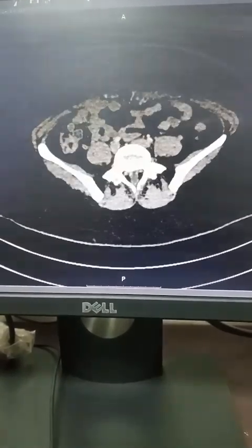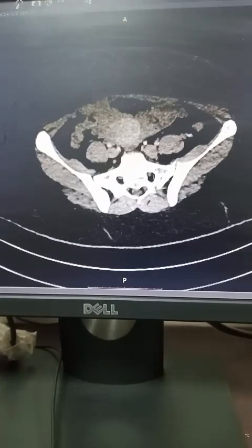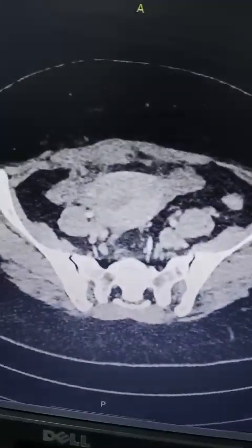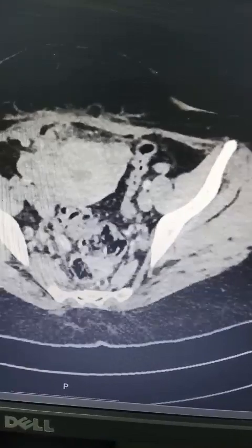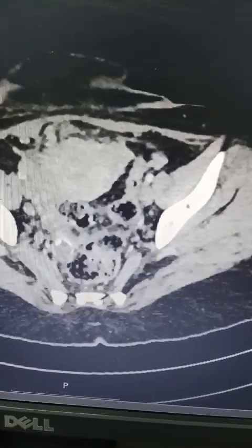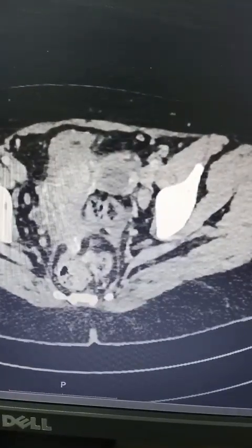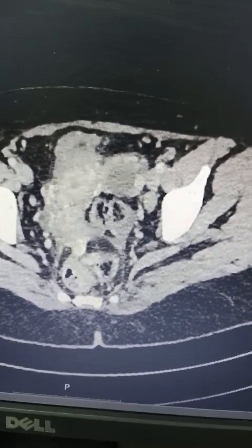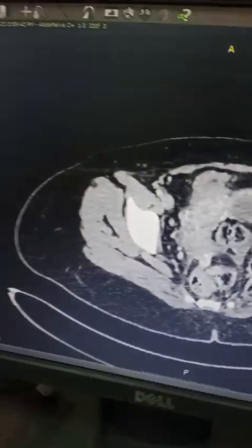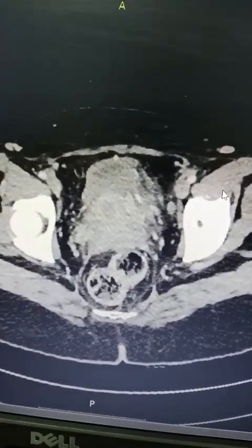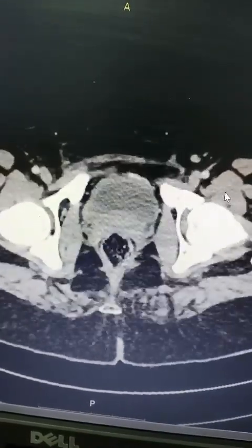Coming down to the iliopsoas muscles and into the pelvis — here comes the uterus. You can see the uterus is a bit bulky. There is some thickening in the endometrial cavity, and you can see inflammatory changes post-C-section along the anterior abdominal wall.